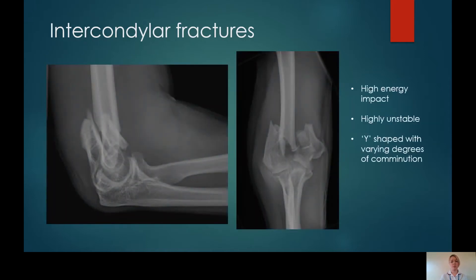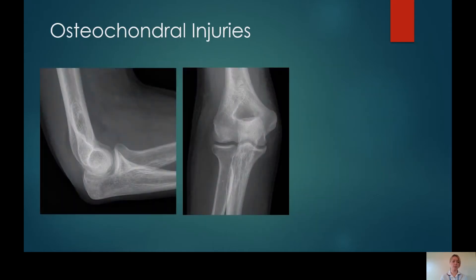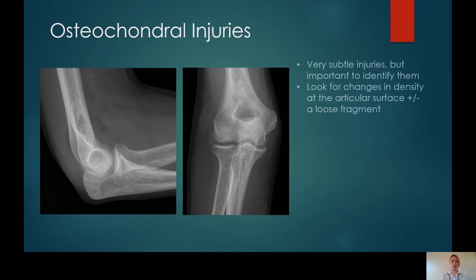A much more obvious injury is intercondylar fractures. These are very unstable and form a Y-shaped fracture configuration, generally caused by high energy impact forces. Osteochondral injuries are very important injuries to be able to appreciate. When looking at these X-rays, the most obvious thing you can see is a pronounced joint effusion, so already you should be thinking that there is an injury present.